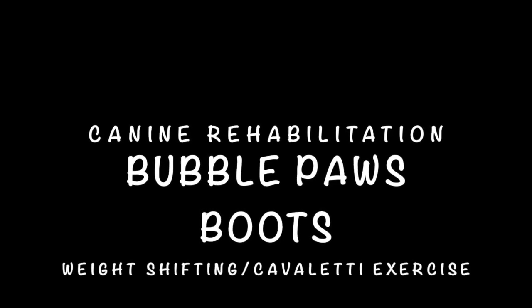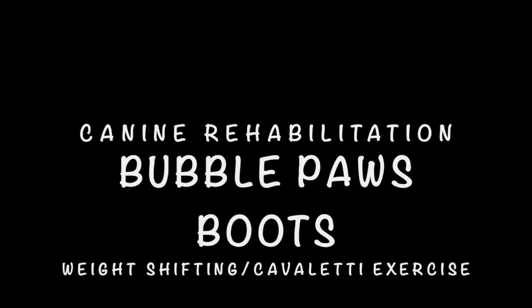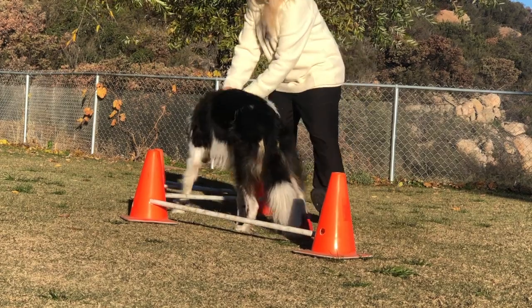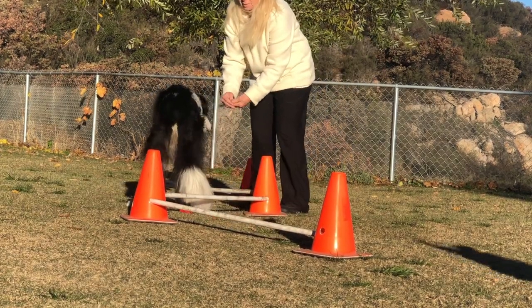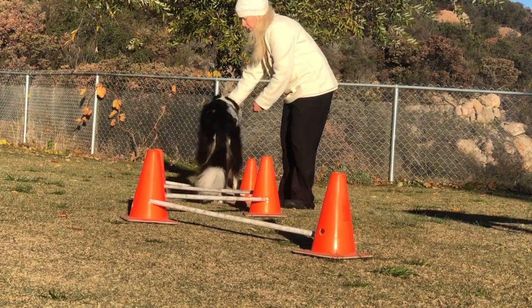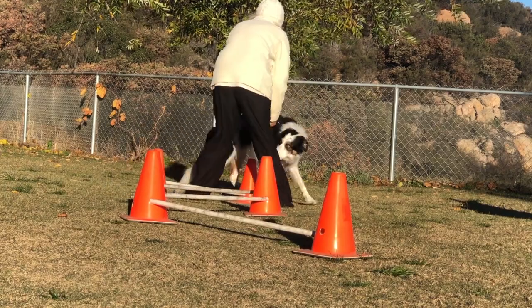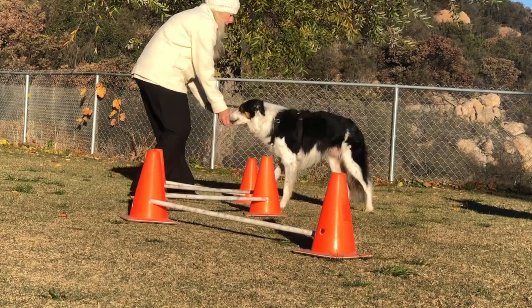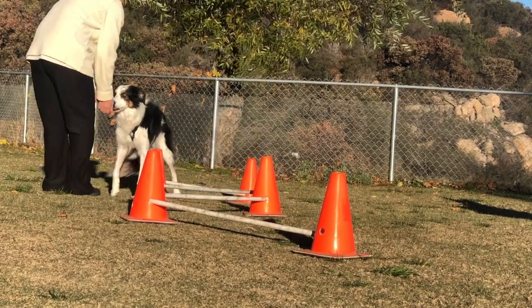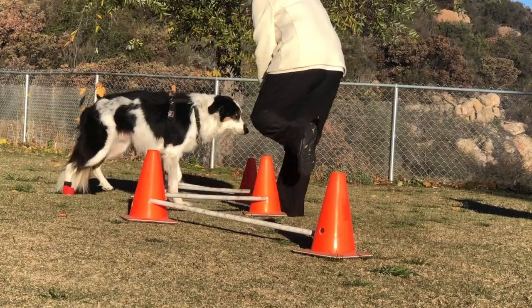Canine Rehabilitation Using Bubble Paws Boots, Weight Shifting, and Cavaletti Exercise. Twix has a bubble paw boot on his right hind paw to encourage him to shift his weight to his left hind leg. The reason the boot is on his right hind paw is because the left hind leg is weaker. Putting the boot on his right paw will cause him to lift his right hind leg higher, and when he lifts his right leg higher, he shifts his weight to the left hind leg. This will help strengthen his left hind leg.